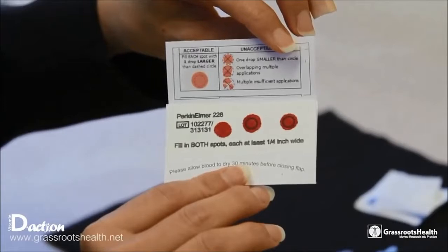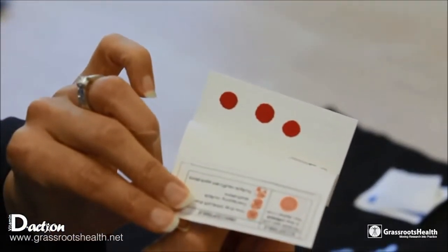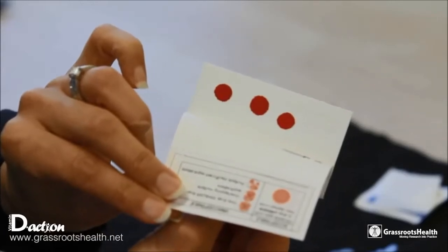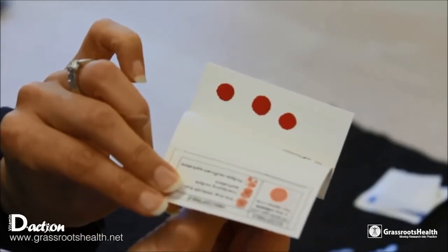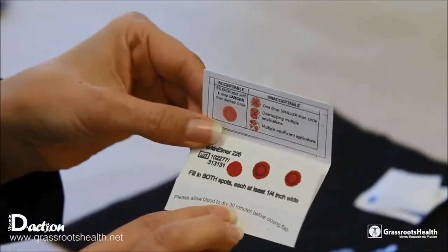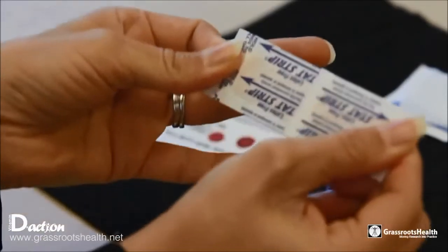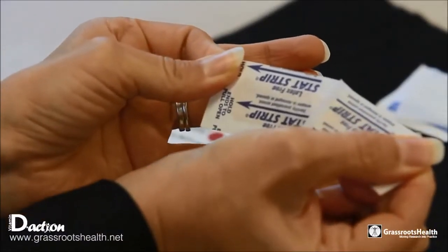Now that you've done this, take a quick look at the back side of the card to make sure that the blood has soaked through. If it has not, you can still wipe with gauze and put on another blood spot. You want to make sure that you have a fully filled up spot that has gone through.